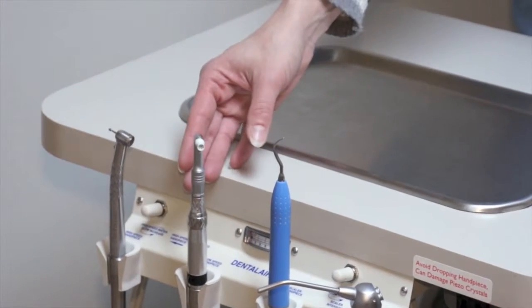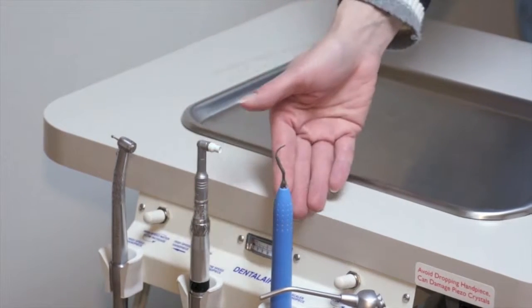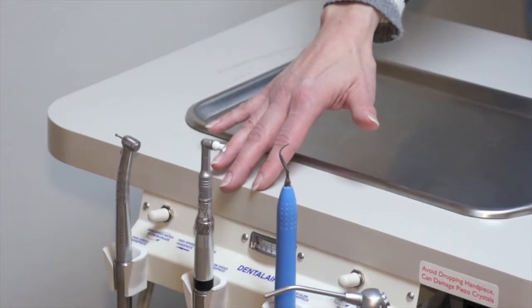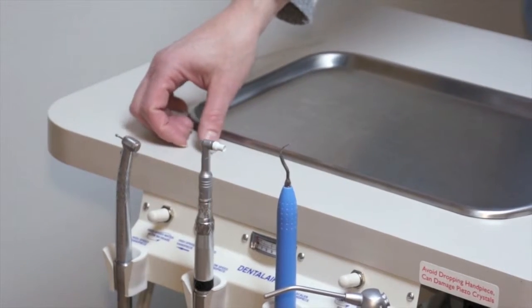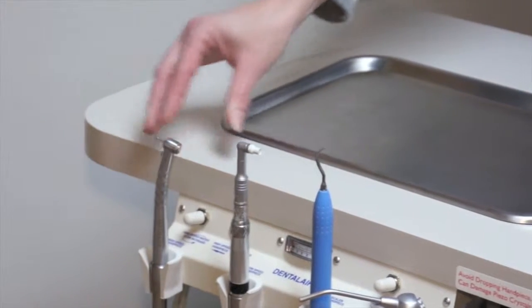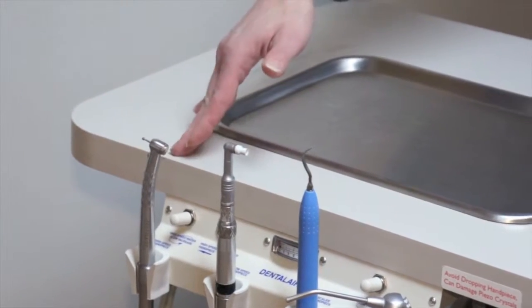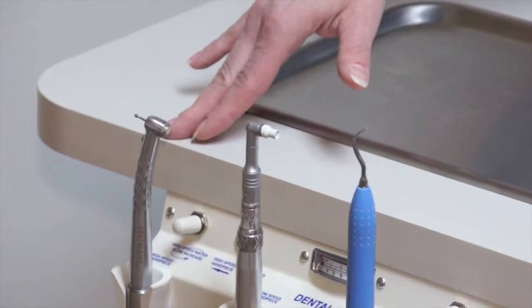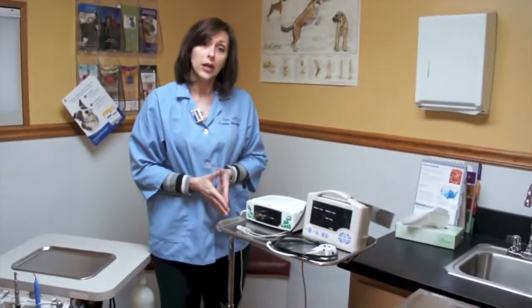The other two parts that we have to this unit is a low speed polishing head. After we scale the teeth, we need to polish to get any of the fine little scratches within the tooth out, and that's the point of the polishing head. And then finally what we have here is the high-speed burr. This is meant actually to cut roots and even burr down roots of teeth, especially if they're very difficult to remove during extracting.